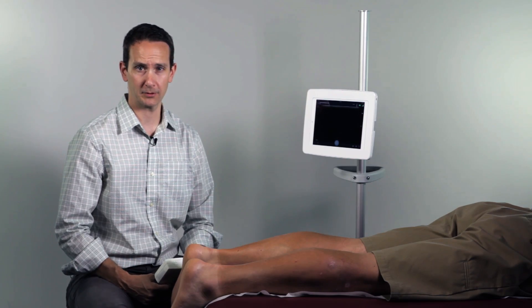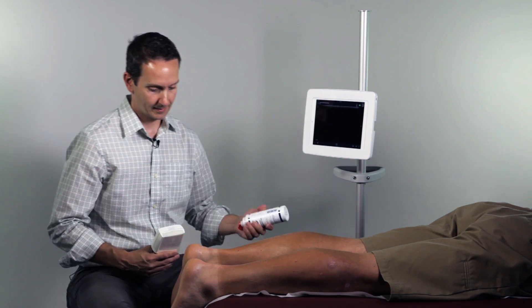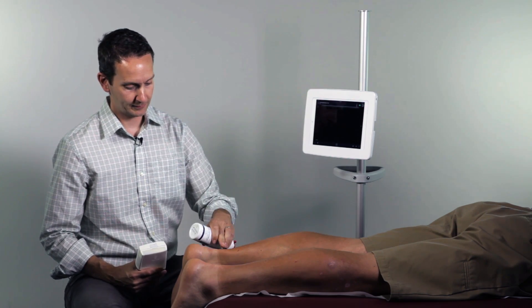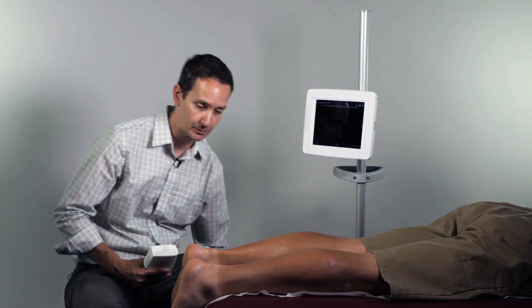Begin with your patient in a prone position with the feet just extended off the edge of the bed. Due to the curved nature of the posterior heel, a lot of gel will be required in order to remove any potential air gaps.